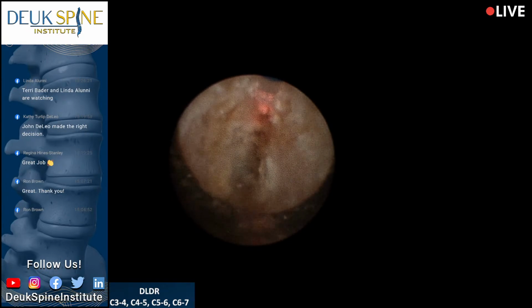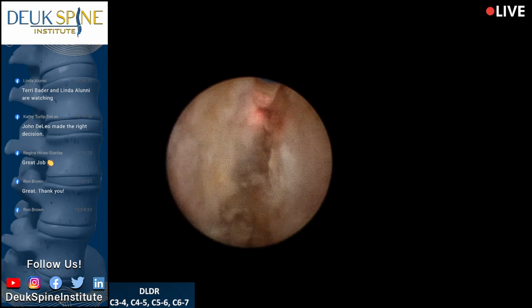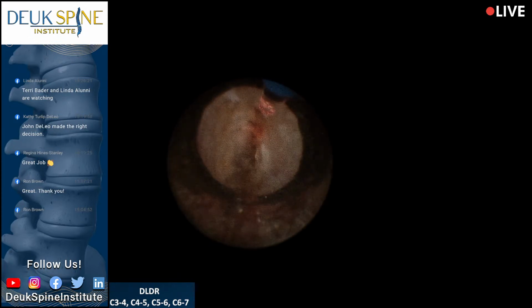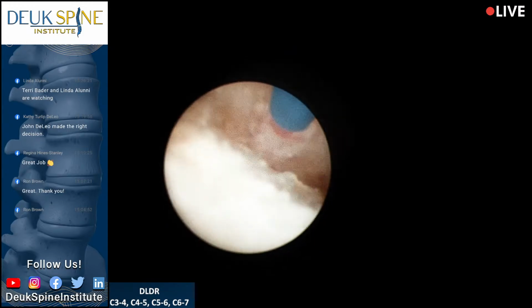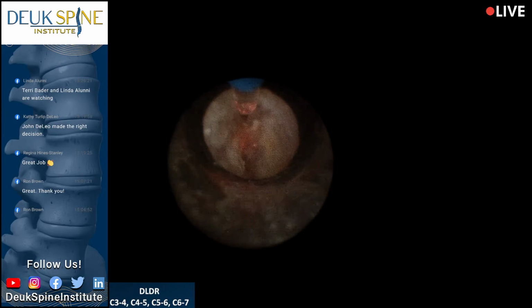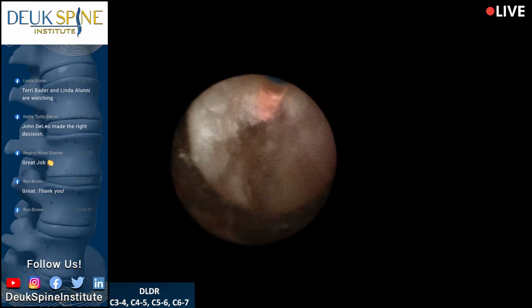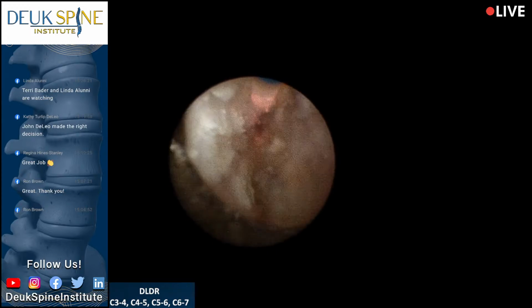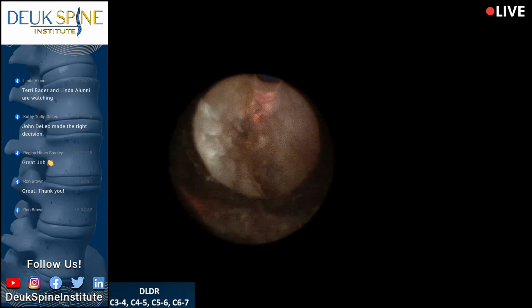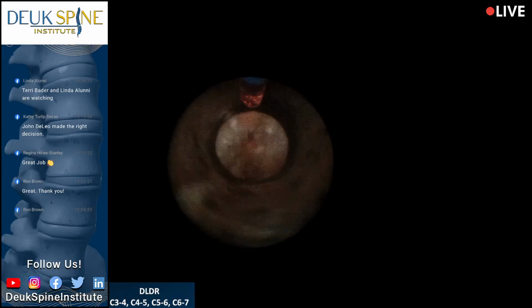You know, once you damage the disc, it's susceptible to re-injury. And this one here, this was just destroyed years ago. And so it really hasn't been injured lately, in the last probably 5-10 years. So these injuries look super old and healed. I don't mean healed in a good way, but healed with scar tissue and bone spur.